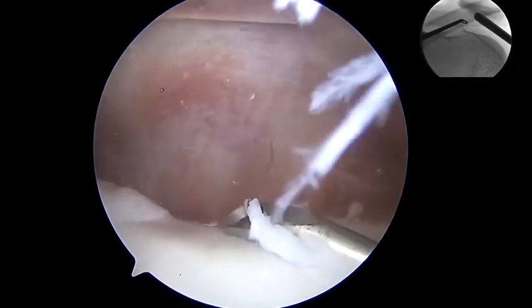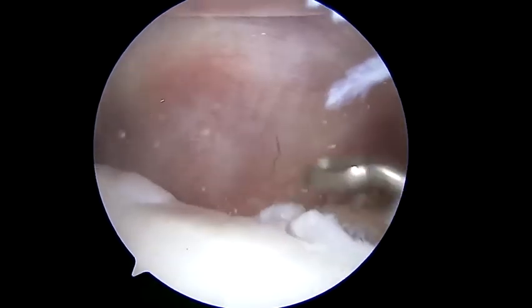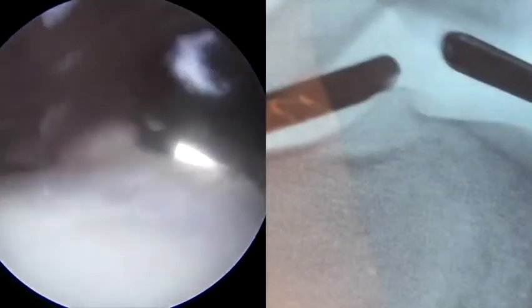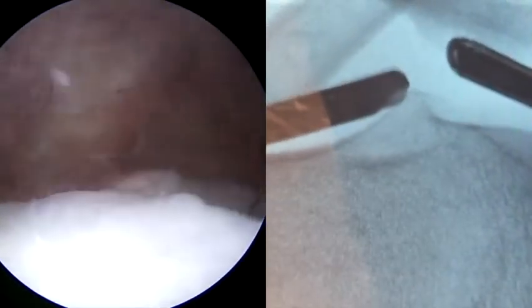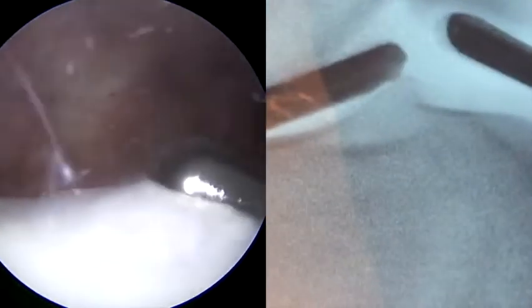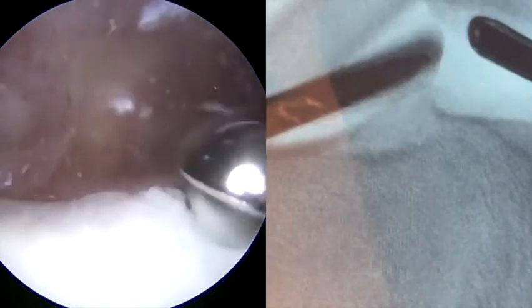We then use a combination of direct arthroscopic visualization and fluoroscopic visualization to use a curette to remove the proximal bump or spur. Once through the cartilage, we move to a bone cutting shaver or bur to resect this to the level of the anterior femur. The goal of the surgery is to create a smooth transition similar to a cam resection for hip arthroscopy, which should allow for less contact pressure on the patella.